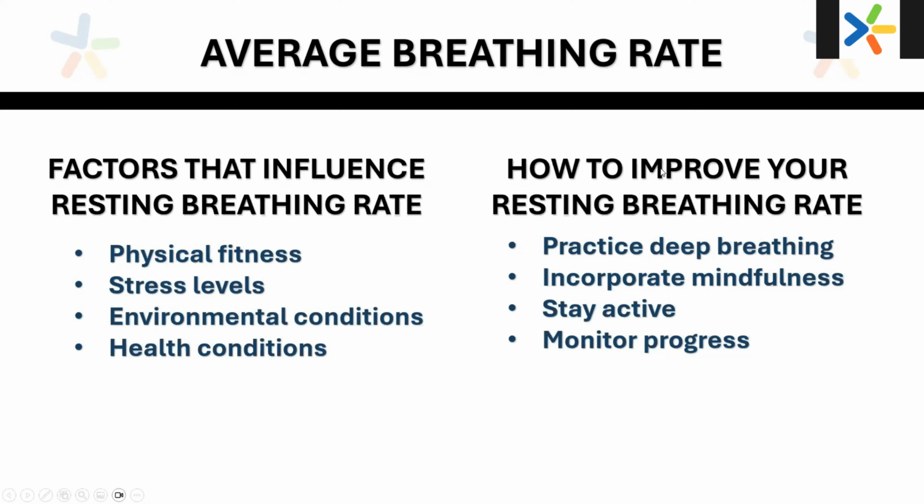So you focus on how to improve your resting breathing rate. So you can set goals with them to practice deep breathing, incorporate mindfulness. This one is big, stay active. So physical fitness, exercise, and monitor progress. So there are things that we can do as individuals to improve our resting breathing rate. Because of this, it's also important that when you run a scan on somebody, make sure that you give them instructions. They need to be in a state of rest, meaning do not run a scan right after working out, because as you know, your breathing rate is going to be higher than normal.